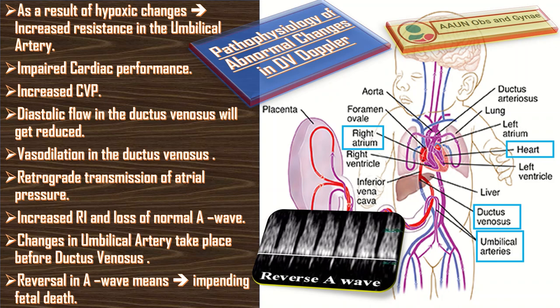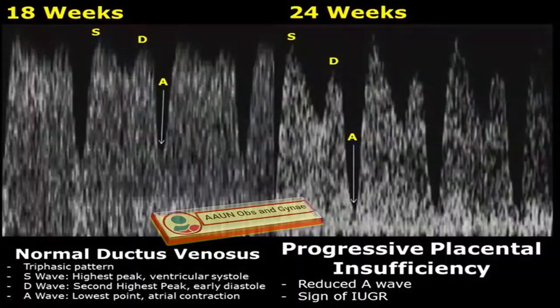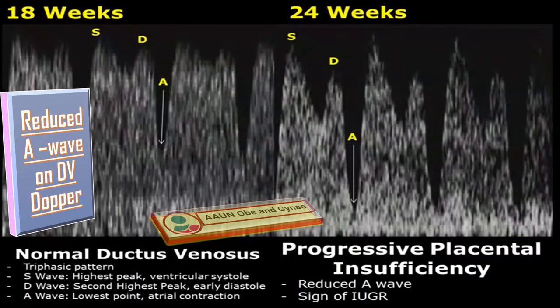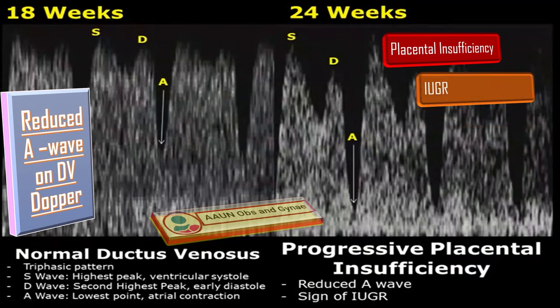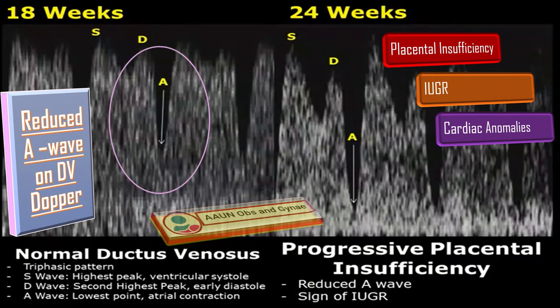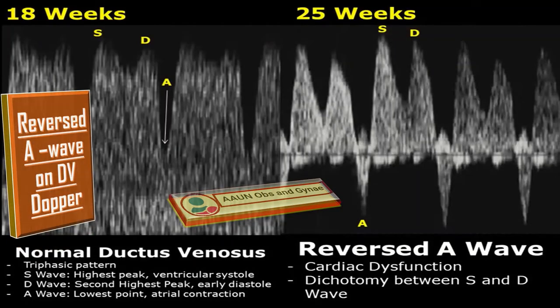Reversal of the A wave is an absolutely abnormal condition and should never ever be underestimated. Before discussing the reversed A wave, let us talk about the reduced A wave. The reduced A wave is very important in diagnosing certain conditions like placental insufficiency, intrauterine growth retardation, and cardiac abnormalities. Here in this Doppler you can see the normal waveform at 18 weeks of gestation, but at 24 weeks of gestation you can see there is a reduced A wave, indicating underlying problems like placental insufficiency or intrauterine growth retardation.